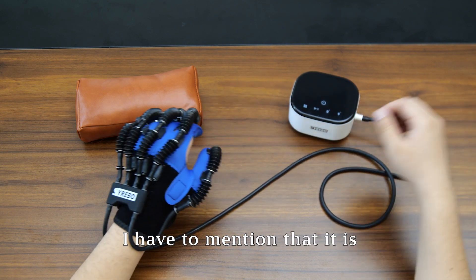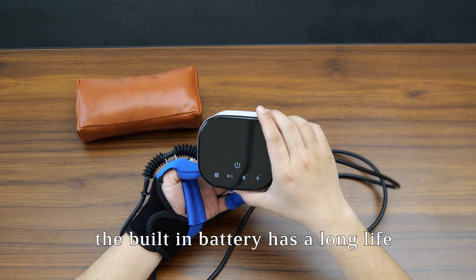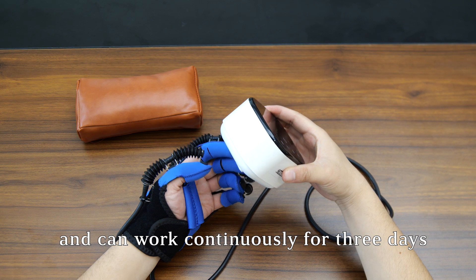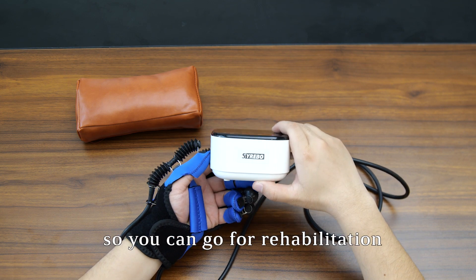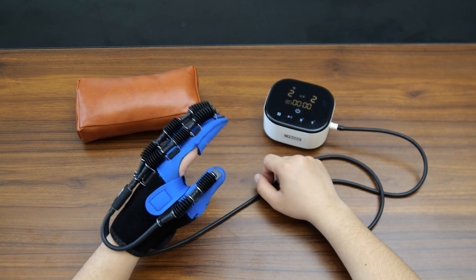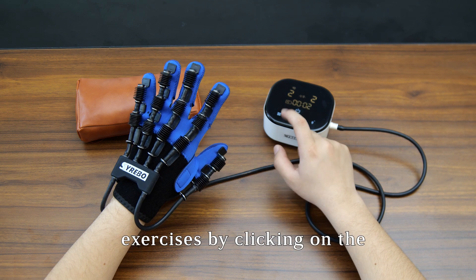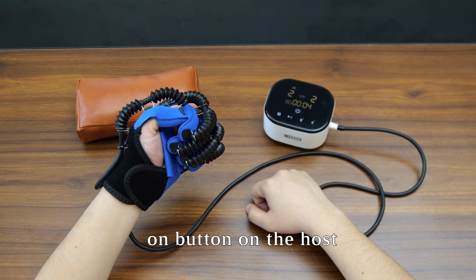Once the gloves are on, we connect the host. The host is portable and practical — the built-in battery has a long life and can work continuously for three days, so you can go for rehabilitation exercises anytime and anywhere. With the gloves on, start the exercises by clicking the on button on the host.